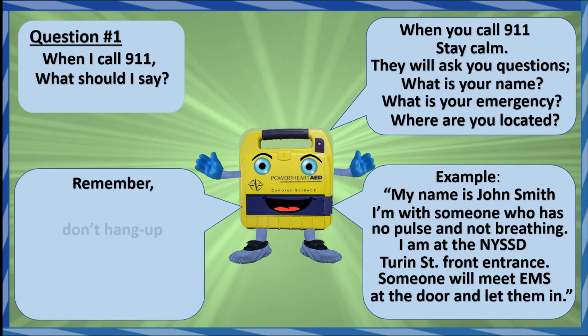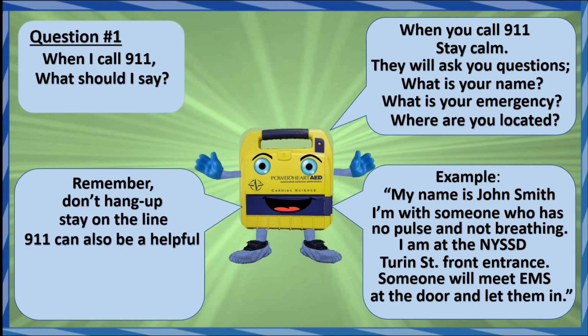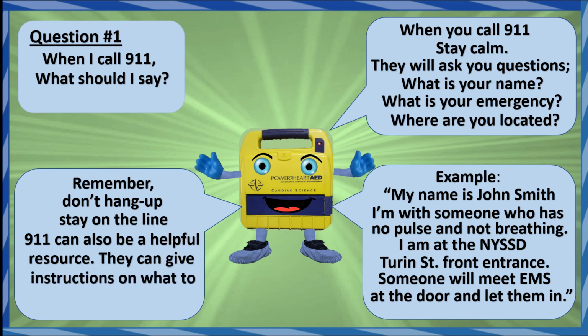Remember, don't hang up. Stay on the line. 911 can also be a helpful resource. They can give instructions on what to do until EMS arrives.